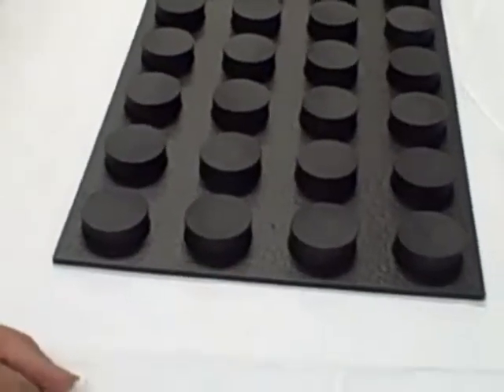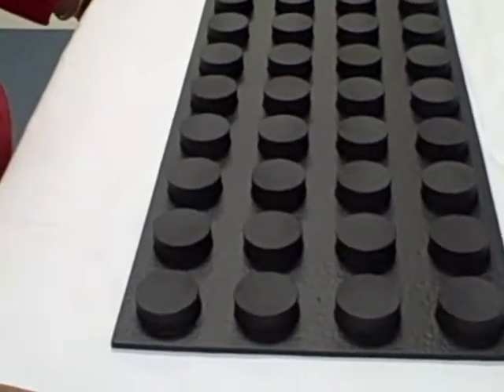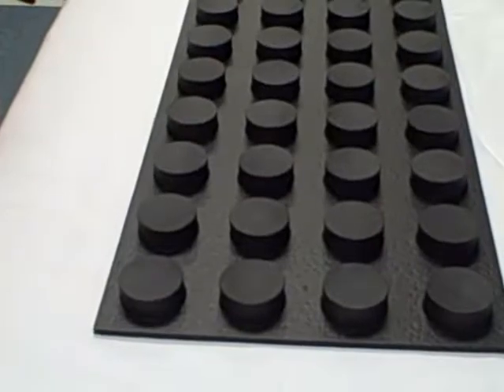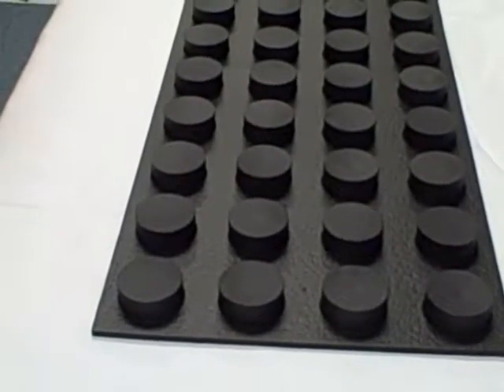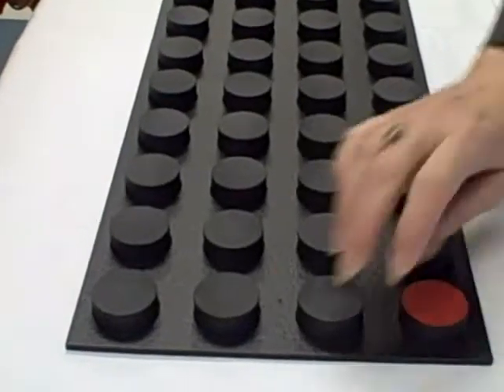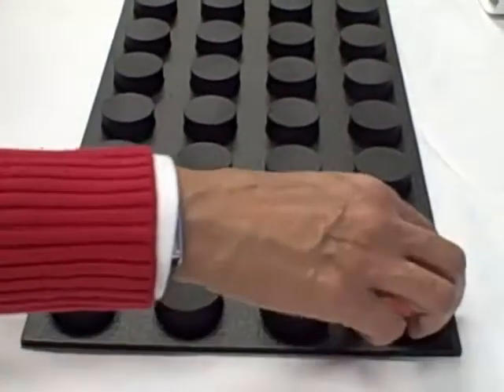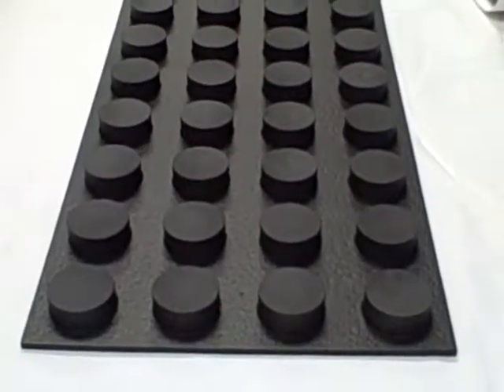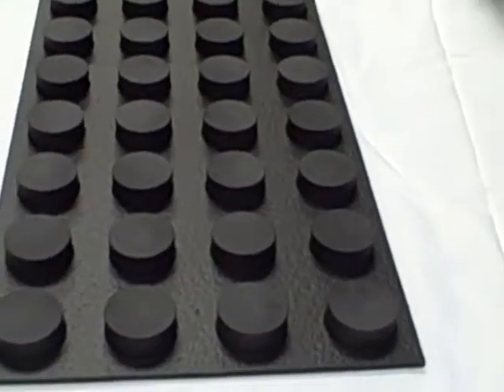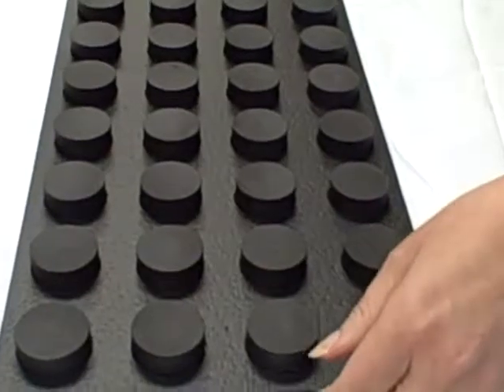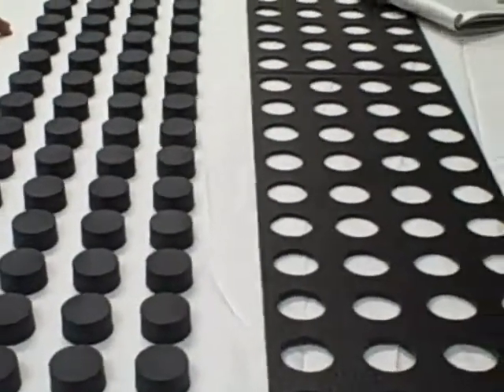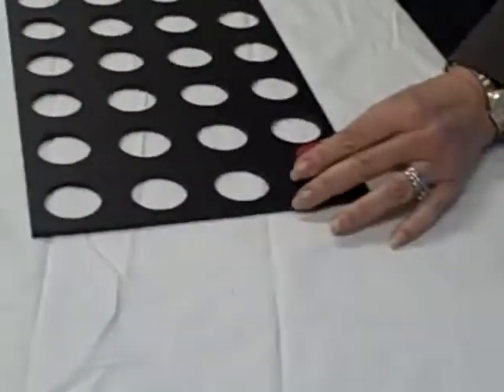Okay, the next one is called the one-handed turning and placing test. So what you do with this one, you tell the client, the object of this test is to see how fast you can put the blocks back in the holes, bottom side up, with one hand. So you're going to turn them over. So begin on your right. Oh, wait, no, that's not right. Sorry. Actually, this one you do with them, you take this off again. Sorry. And so what they're going to do now is with one hand, you'll pick up the peg, turn it over, and put it in the hole.